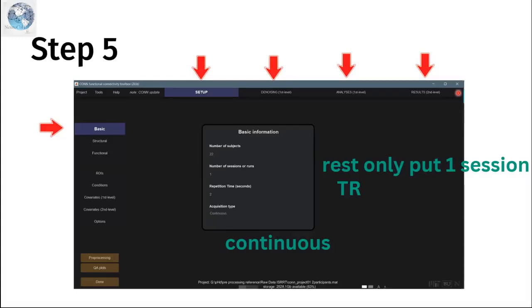Meaning that if I want to show here, you must attend the workshop for 3 days to finish one session at least. So that's why I screenshot here to show you the first step for setup. You cannot just skip this step to go for the analysis. If you're not finished with setup, the system cannot recognize your images.